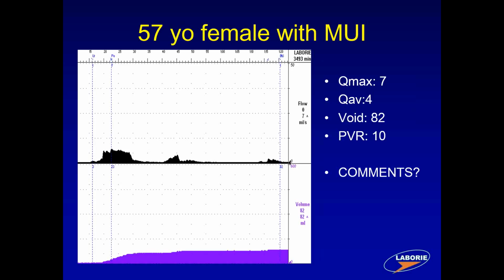And that's solely because her bladder may be having bladder changes as she gets older, technically gets a little weaker. Whereas men have a prostate, and their prostate grows. So a young guy in his 20s should have a flow rate of about 20. And as he gets older, if he's 57 or 60, his flow rate's usually going to be in the mid-teens. But 7 is weak. 7 is weak for both men and women. And it's low, but in this case, I don't know if she's low because she's obstructed or if she's low because she's not making enough urine.